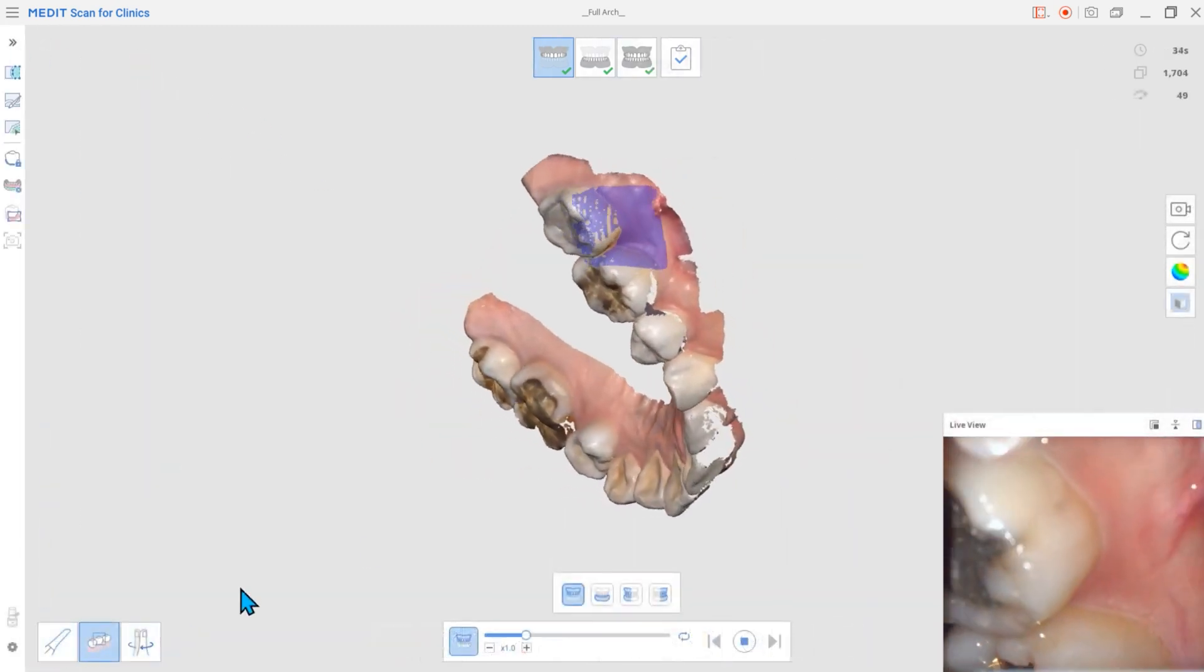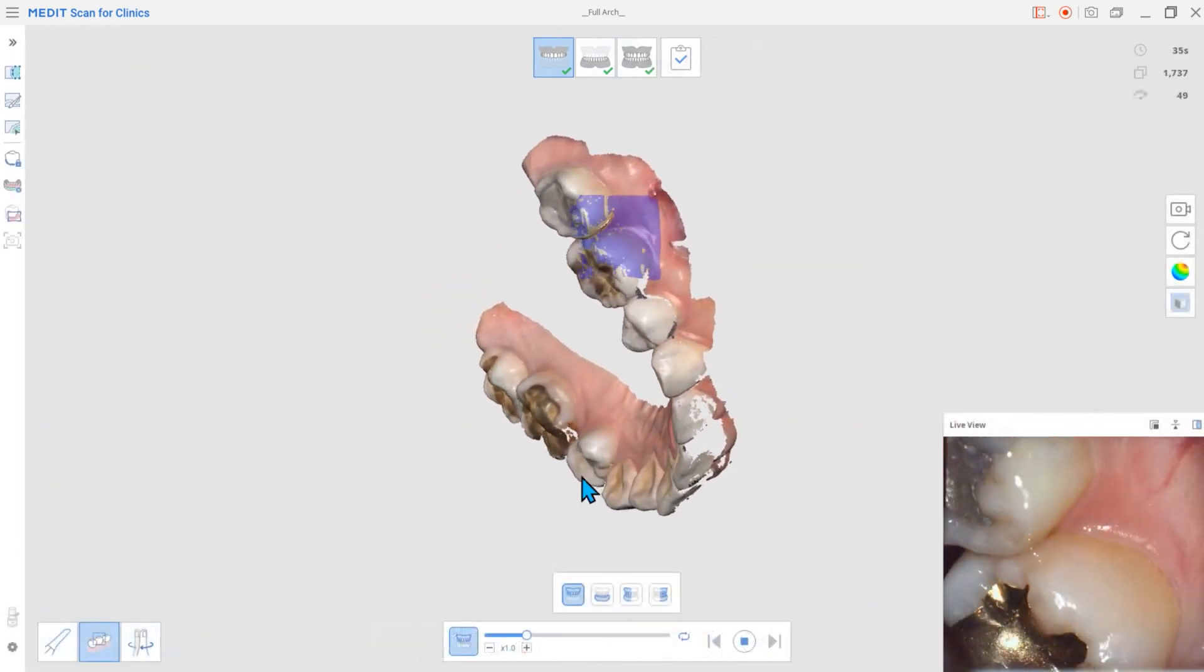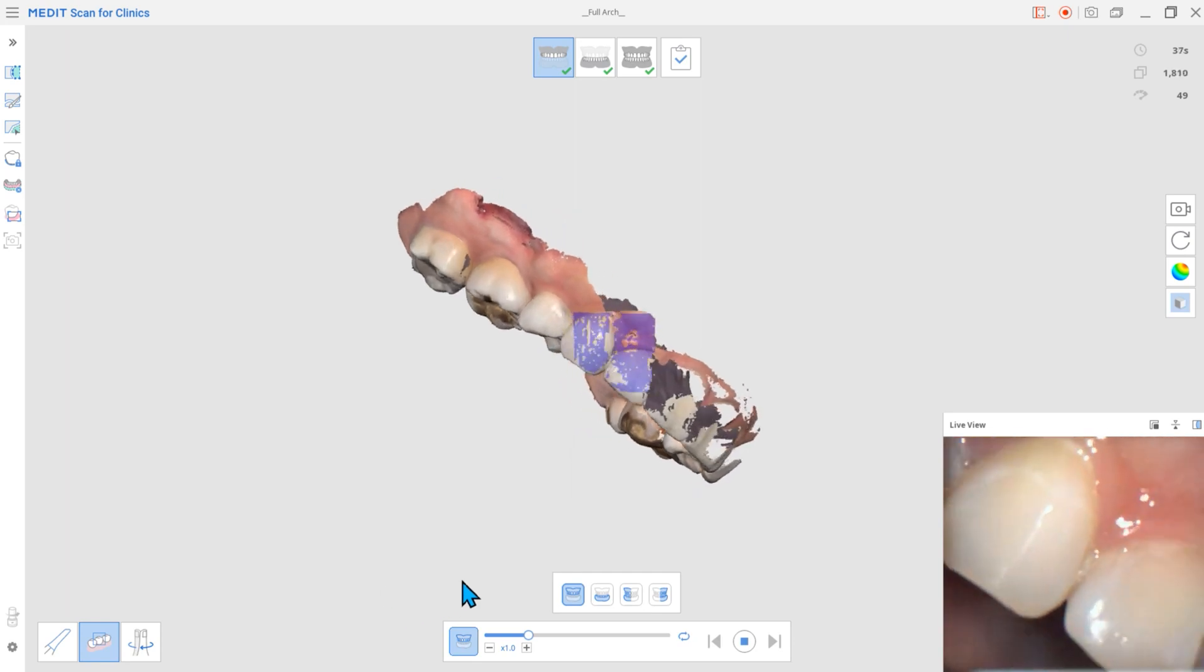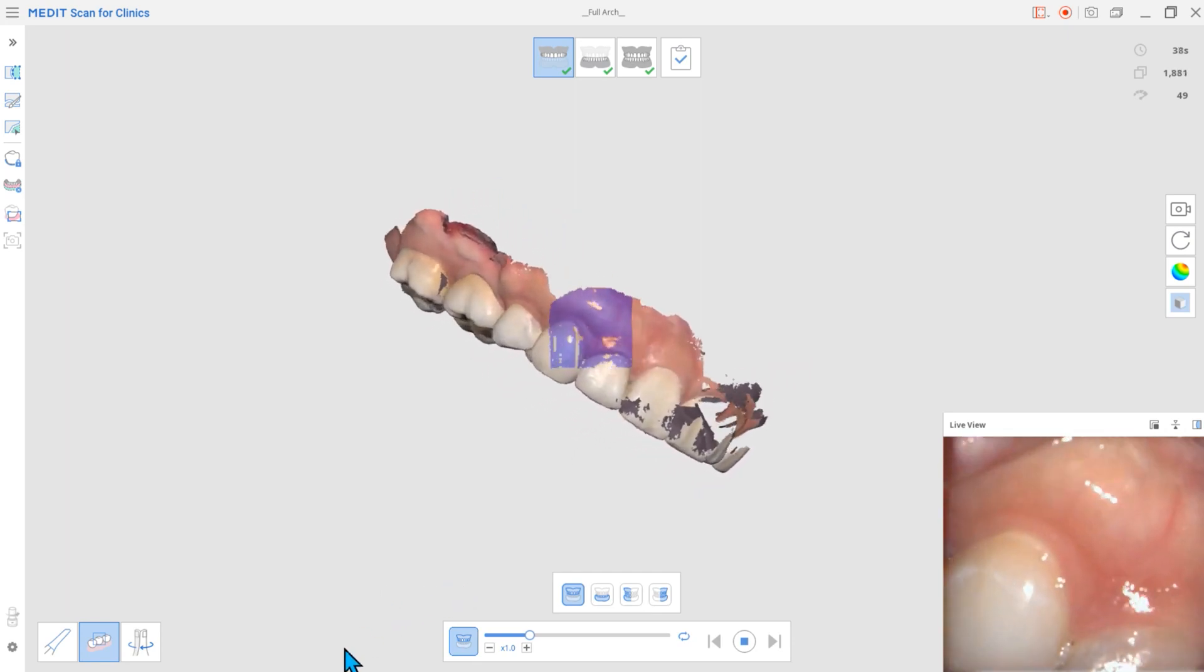When scanning, the data you're checking will be enlarged to help you concentrate on the scanned data.